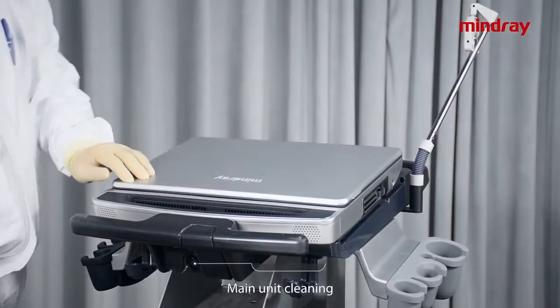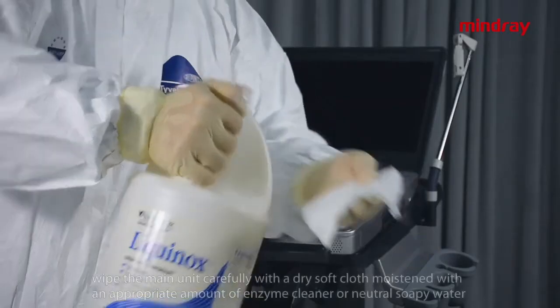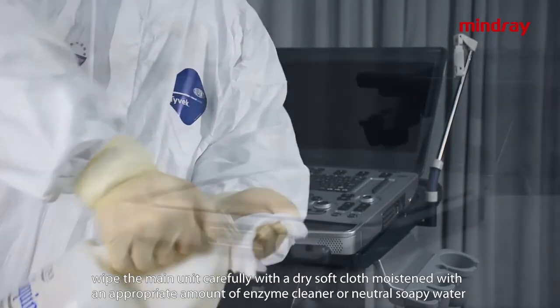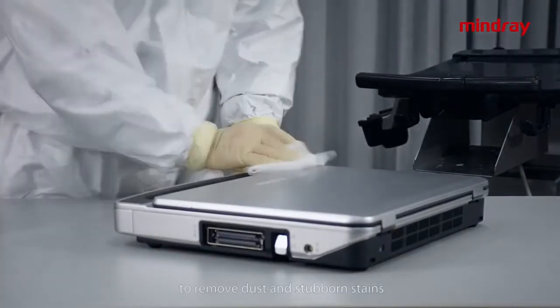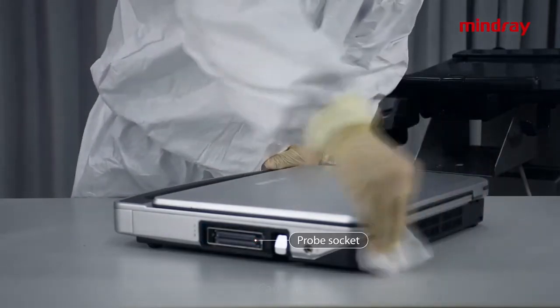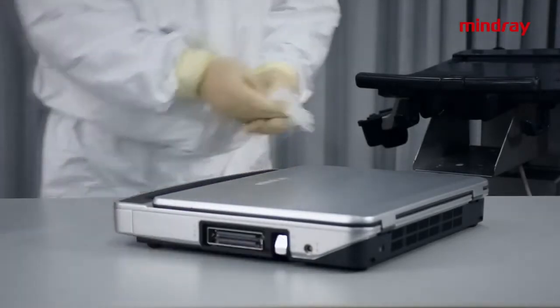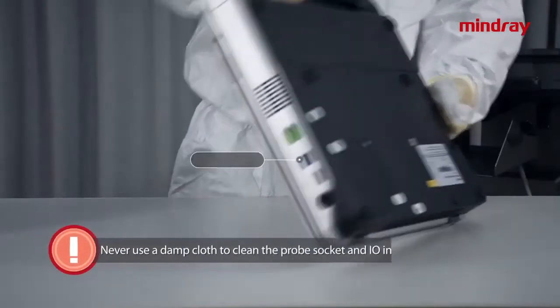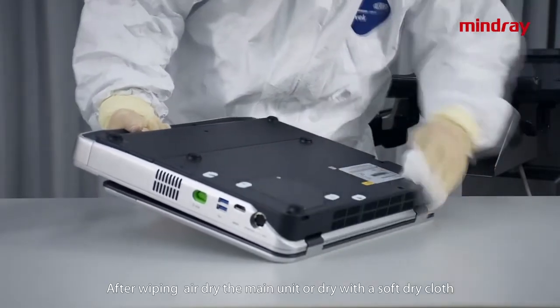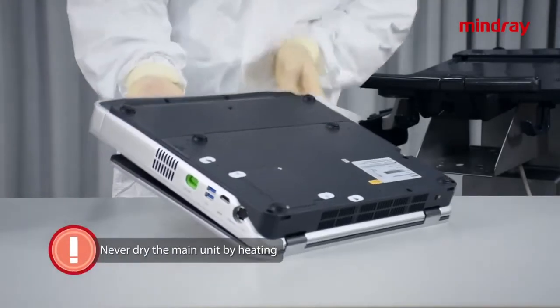Main unit cleaning. Remove the M9 main unit from the trolley. Wipe the main unit carefully with a soft dry cloth moistened with an appropriate amount of enzyme cleaner or neutral soapy water to remove the dust and the stubborn stains. Caution: never spill liquid into the main unit. Never use a damp cloth to clean the probe sockets and the I/O interface. After wiping, air dry the main unit or dry with a soft dry cloth. Never dry the main unit by heating.